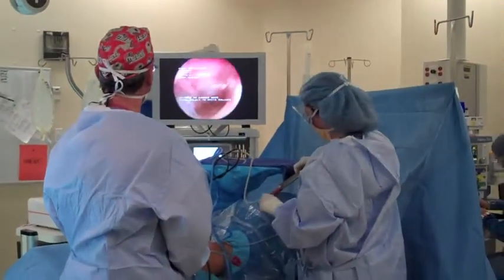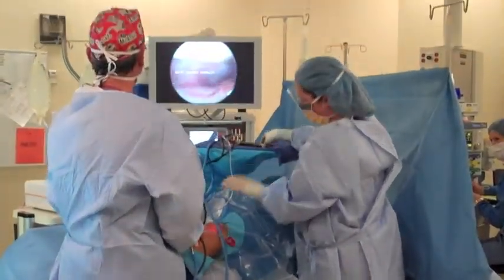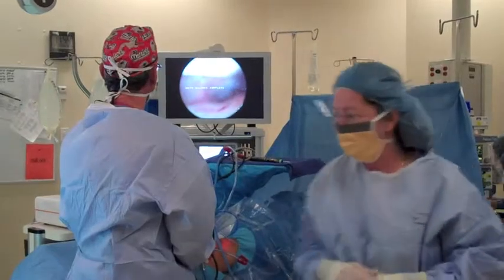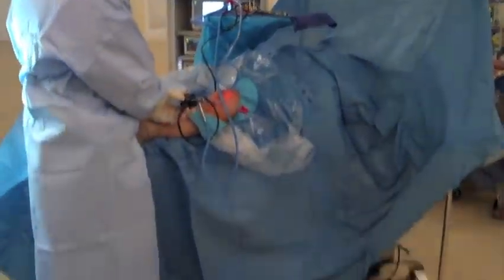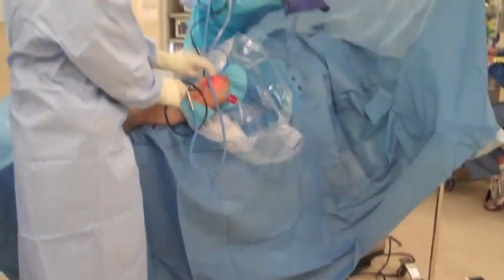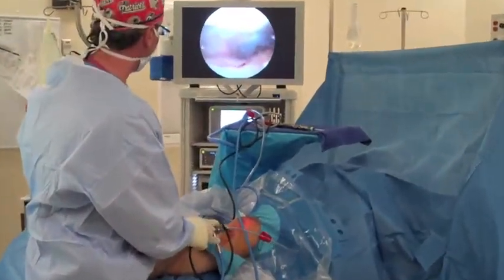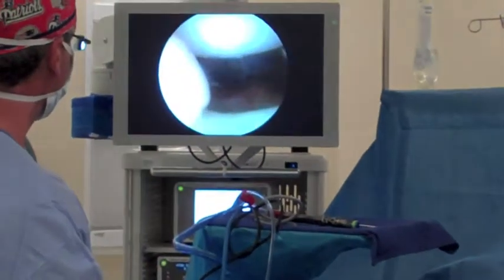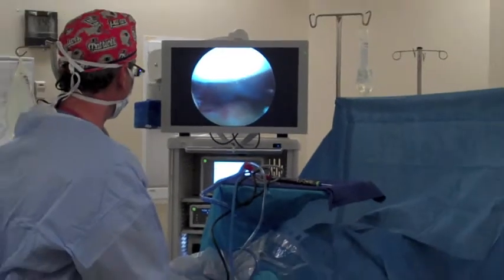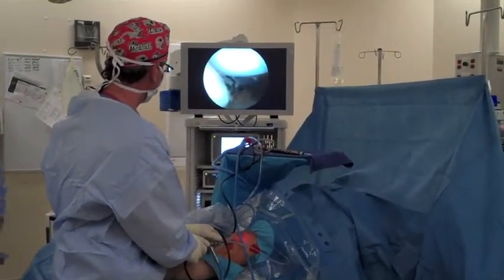So welcome to the actual operating room, everyone. And at this point right now, what I've done is I've made 2 small incisions, and I've actually put a very small camera inside the knee joint, which basically is attached to this device right over here. It allows me, with this line, to go directly into this high-definition flat screen up here, and we can actually visualize directly what's happening on the inside of the knee joint. And it's really amazing the technology that we have at this point to be able to see and do all the things that we want to do.